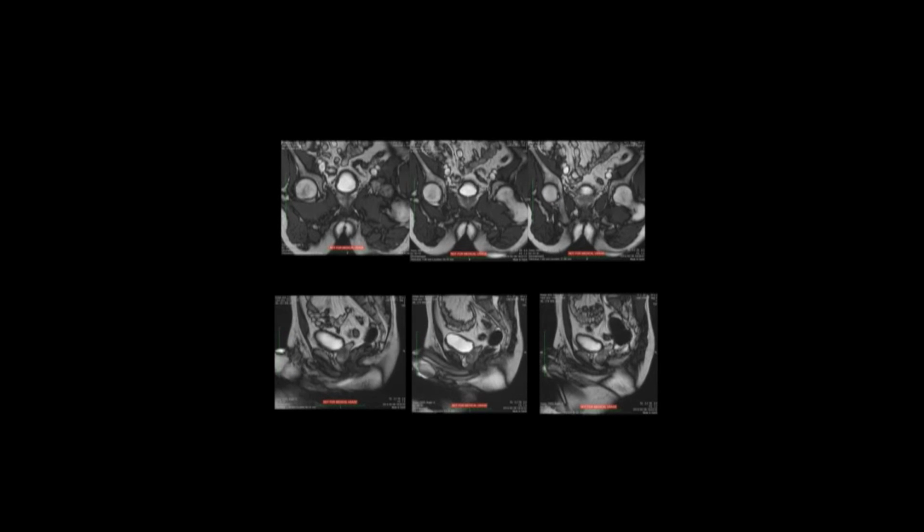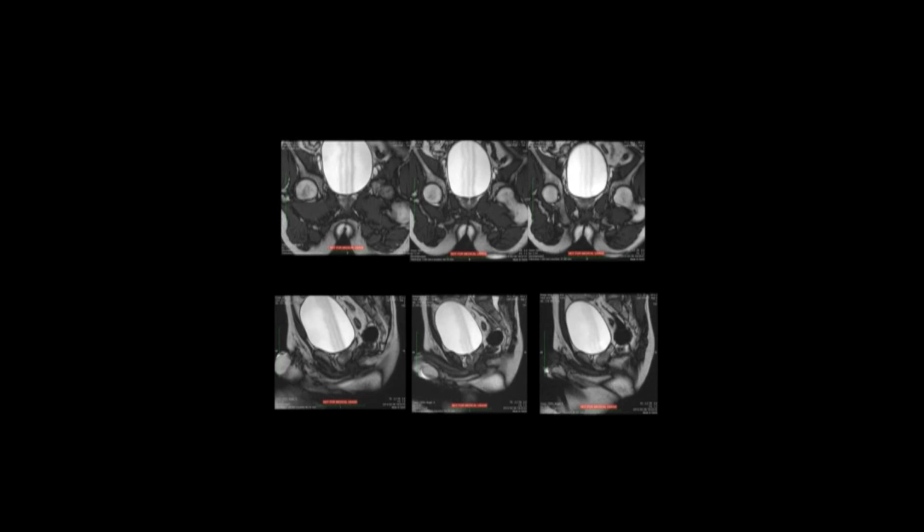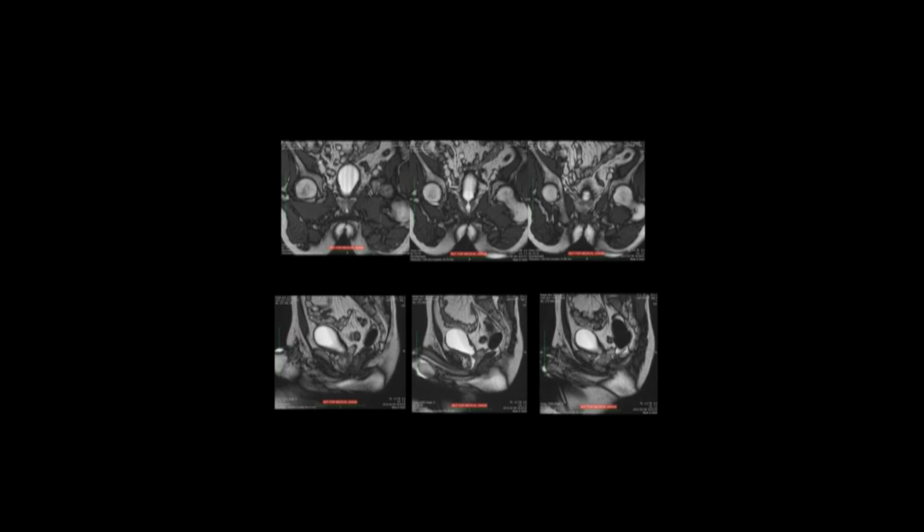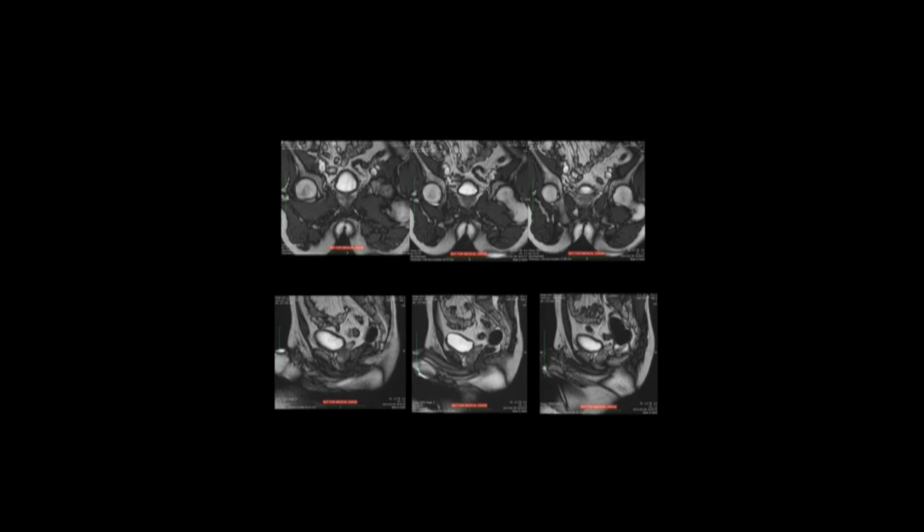In addition, 2 more images were collected, bilaterally, 1 centimeter from the midplane. 3 coronal planar images, at the midplane including the center line of the urethra, and 1 centimeter in the anterior and posterior directions were collected. In total, 6 planar images were obtained. Images were collected until the end of voiding.